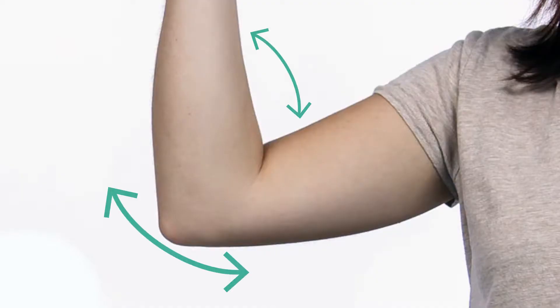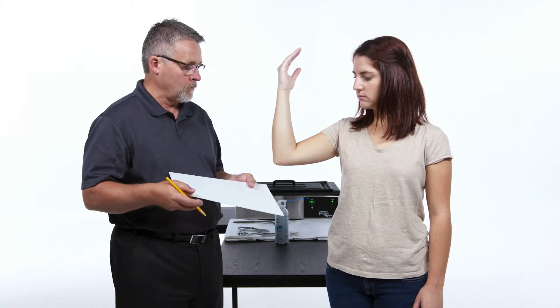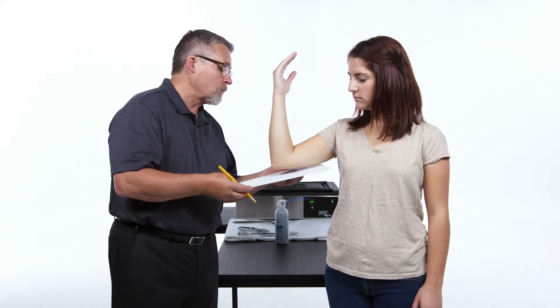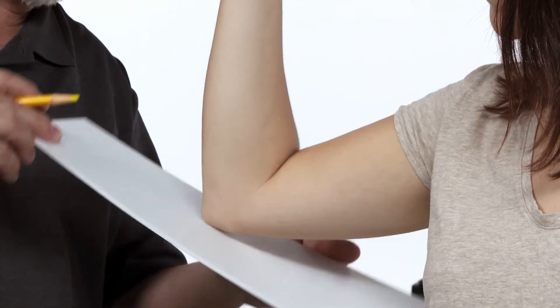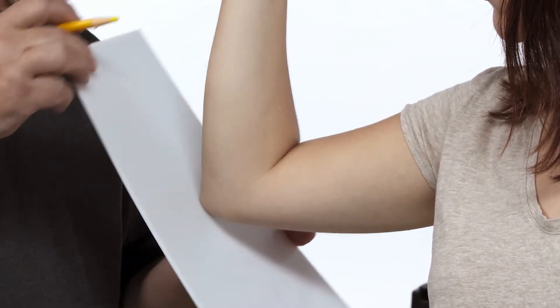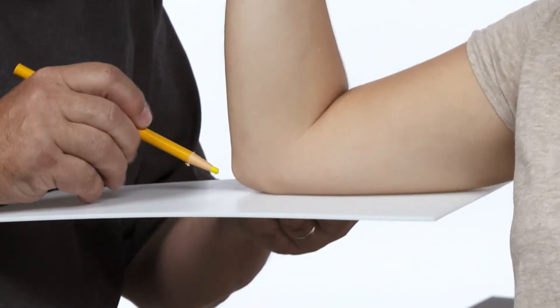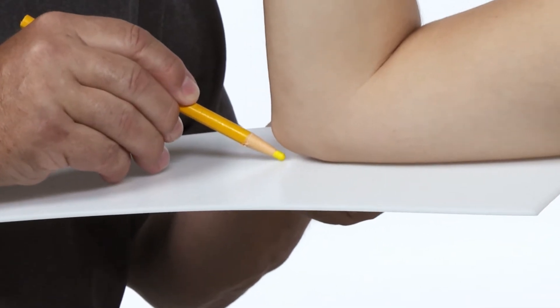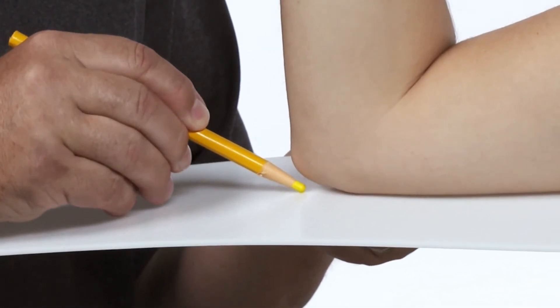Position patient's elbow to desired flexion extension. Place the unheated material against the patient's arm to ensure the proximal and distal borders are 2 thirds the distance to the elbow. Place a mark on the splint material where it touches the olecranon with a grease pencil.